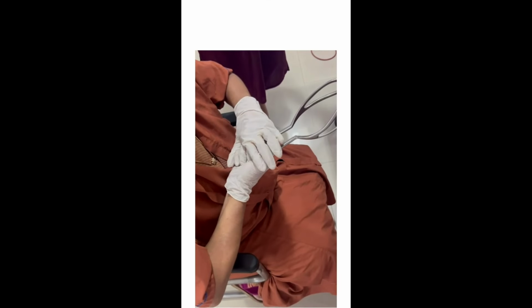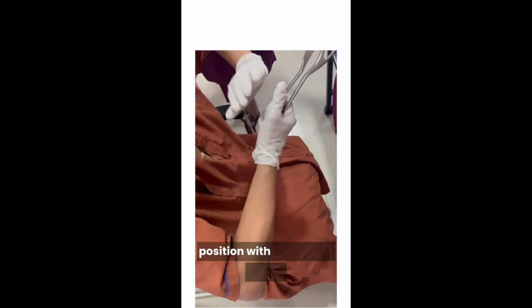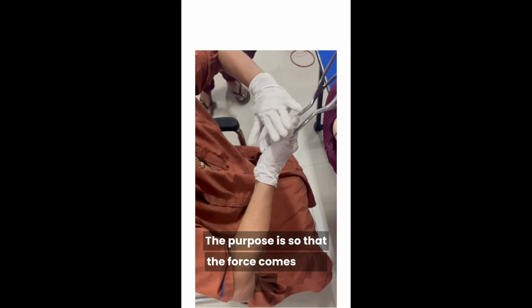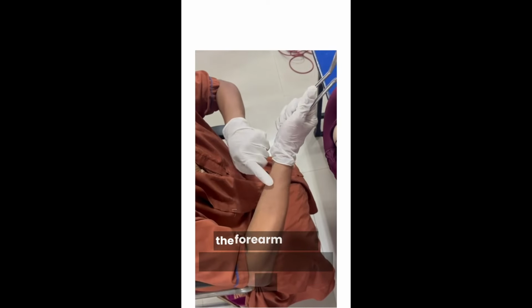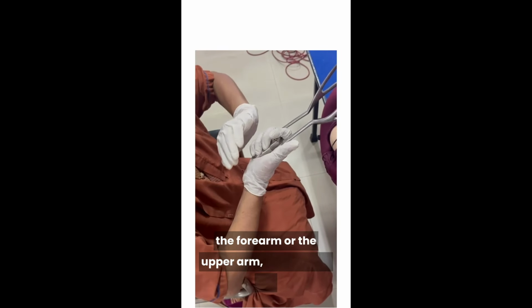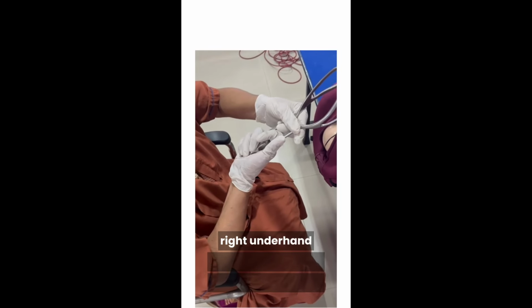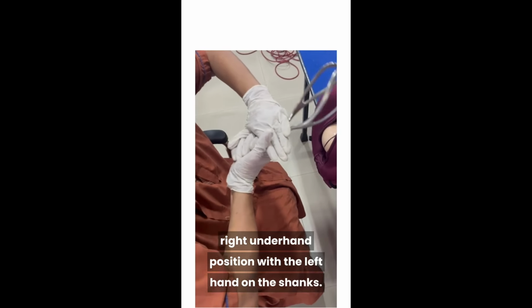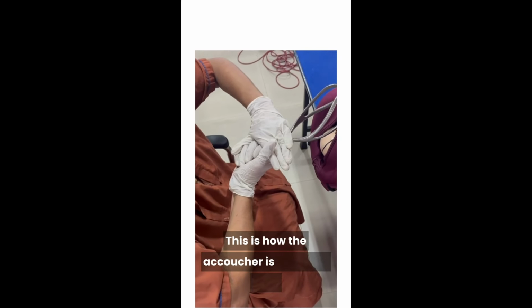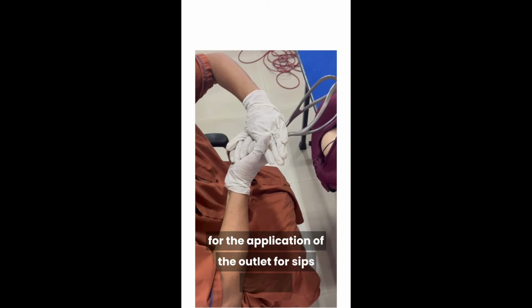The position of the accoucher: the accoucher should be in sitting position with the elbows flexed. The purpose is so that the force comes from the hands at the level of the wrist joint, not from the forearm or the upper arm. Holding it in the right underhand position with the left hand on the shanks. This is how the accoucher is expected to sit for the application of the outlet forceps delivery.